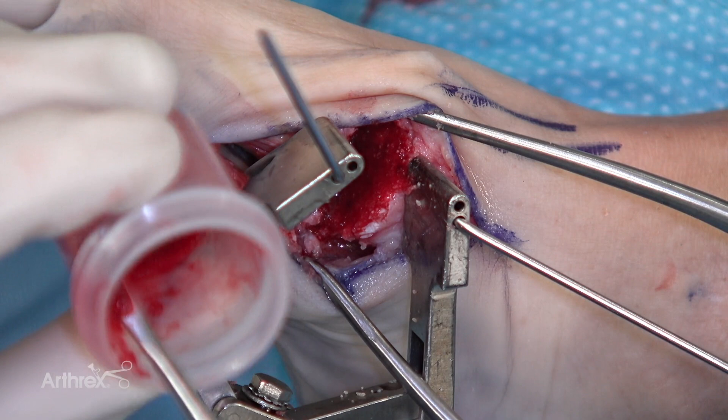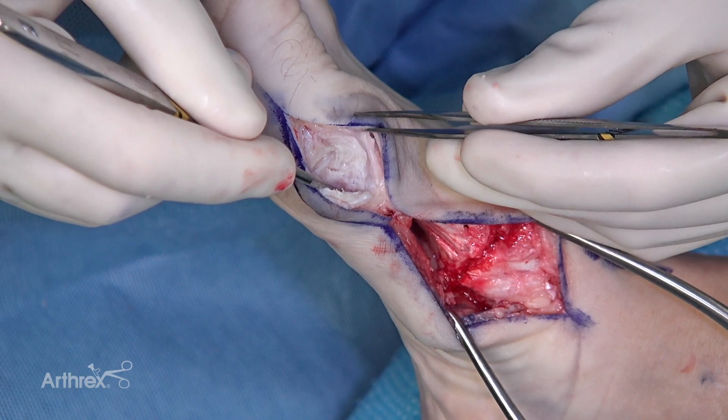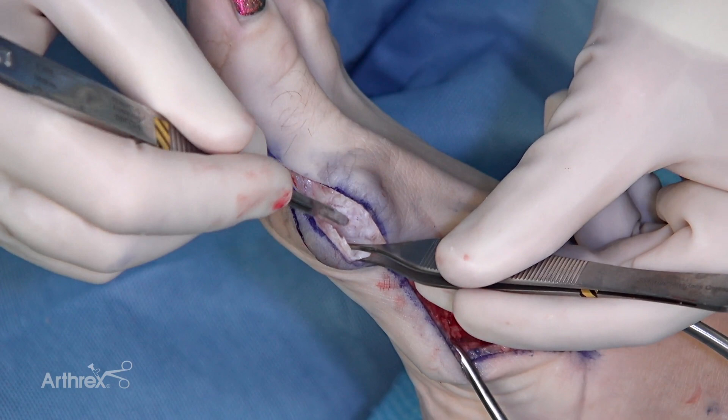Now we're putting allosink mixed with bone marrow aspirate into our fusion site to help facilitate bony healing. I'm exposing the medial side of the first metatarsal — you don't always have to do this, but she's got a large IM angle, so as far as reduction is concerned, I certainly want to be able to grab this structural bone here before I remove it.